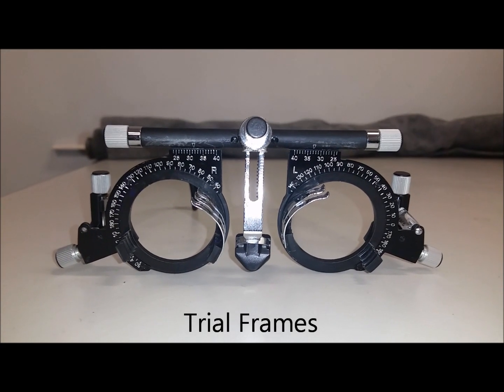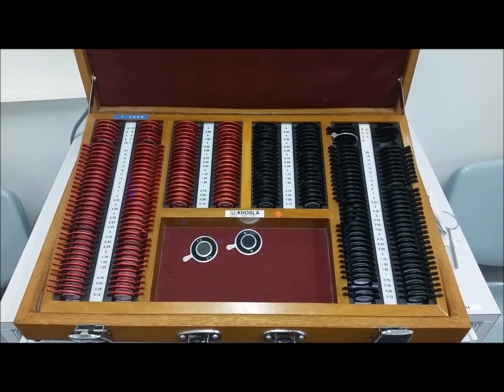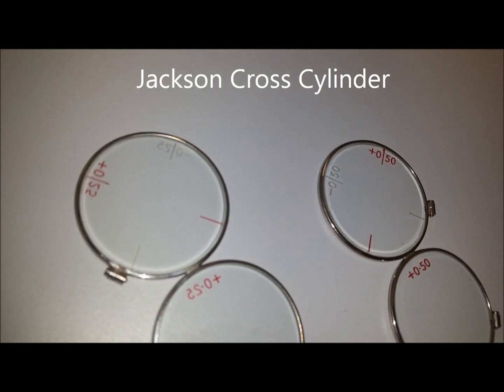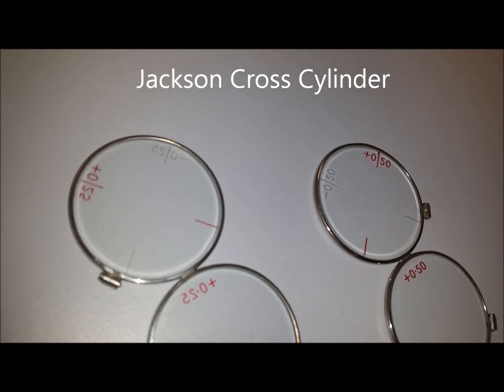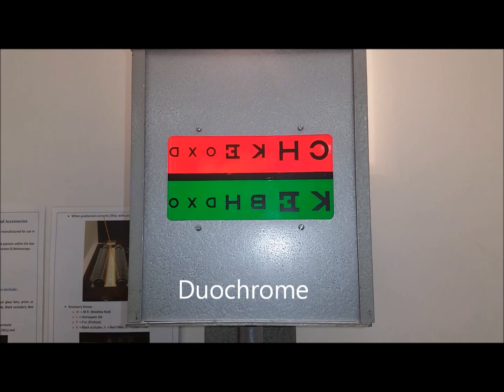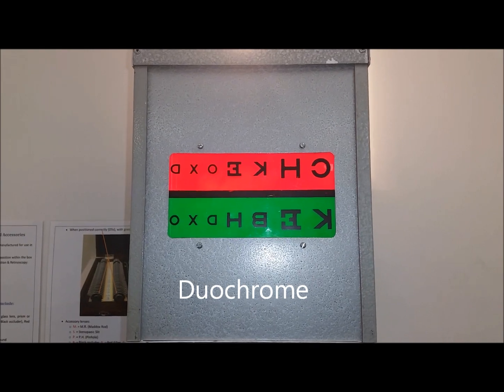Throughout this examination, the orthoptist will use the following equipment: trial frames, trial lens box including pinhole and occluder, Jackson cross cylinder, which is a combination of two cylinders whose powers are numerically equal and of opposite sign, and whose axes are perpendicular to one another. This is used to search for astigmatism. Snellen chart, and the duochrome, which is used to check the spherical component of the refraction.